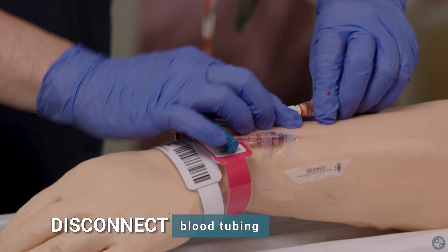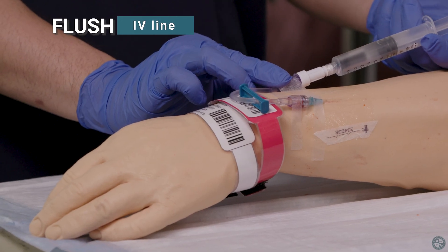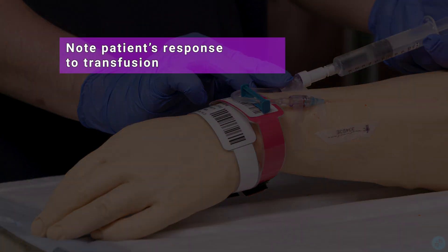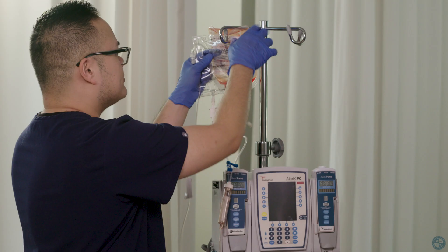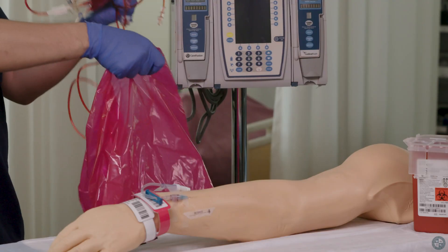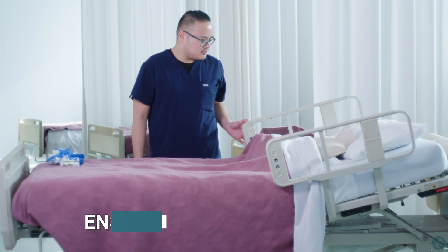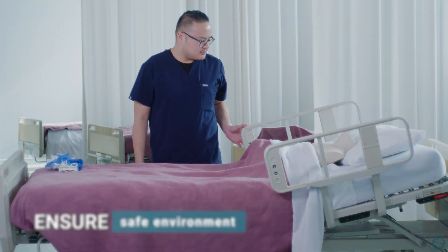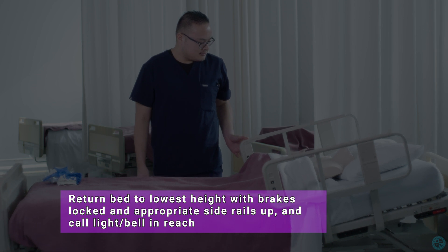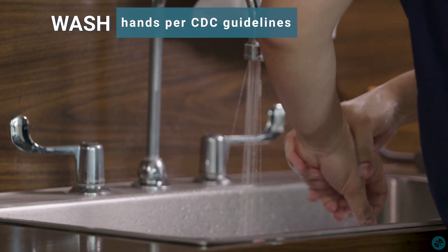Disconnect blood tubing. Flush IV line. Note patient's response to transfusion. Discard tubing and blood bag. Dispose of soiled supplies. Ensure safe environment. Return bed to lowest height with brakes locked, appropriate side rails up, and call light within reach. Wash hands per CDC guidelines.